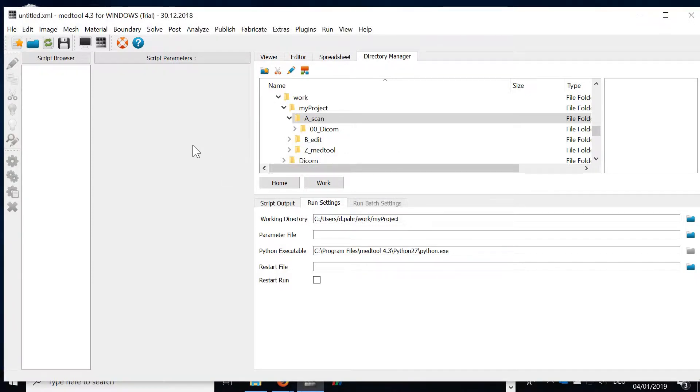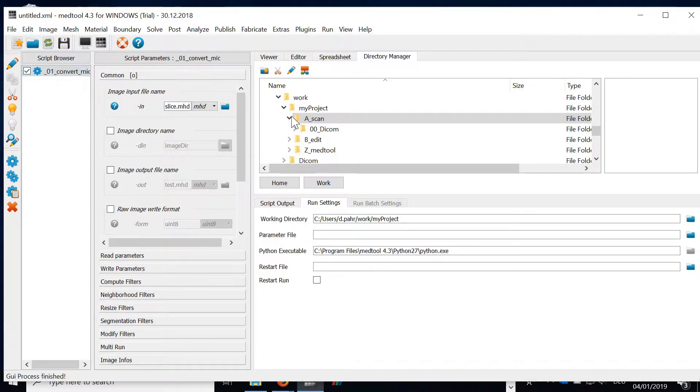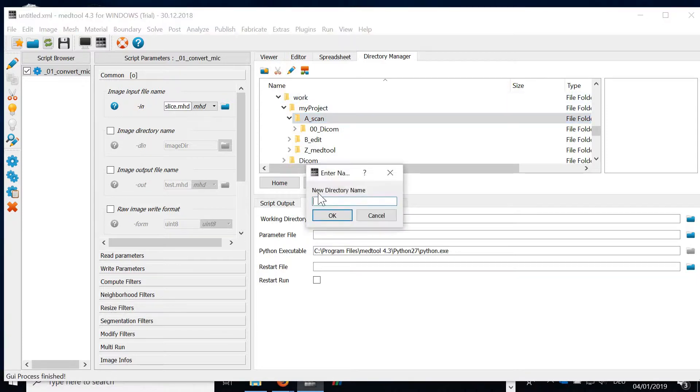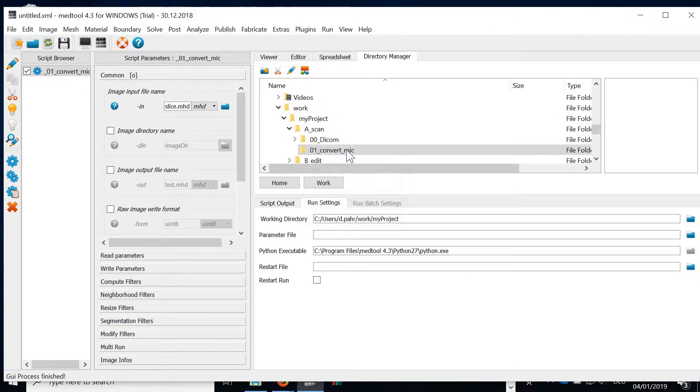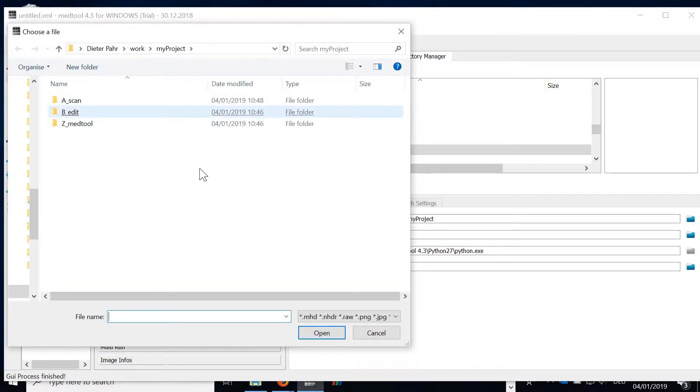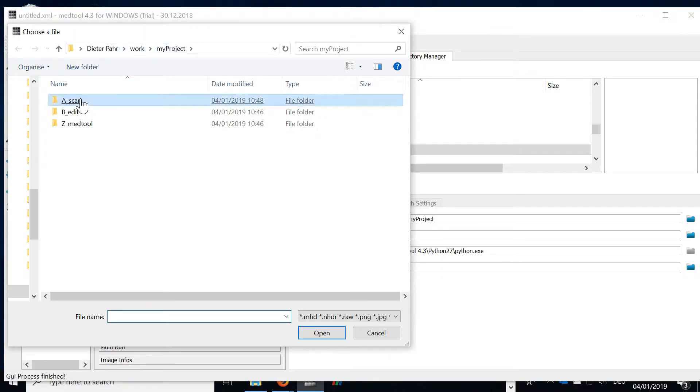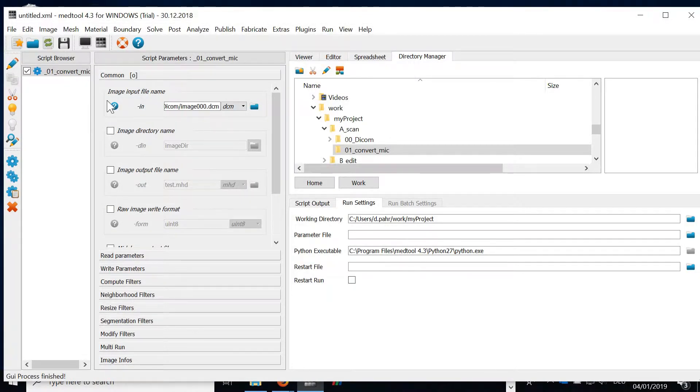By clicking OK the script is created. I'm also creating a folder here which I give the same name. Now I'm ready to read here the DICOM data. I can select a DICOM file.